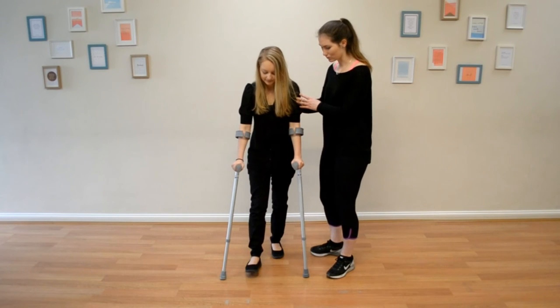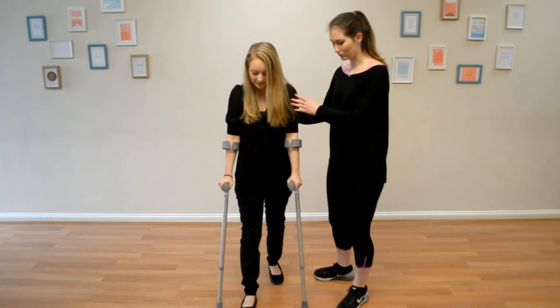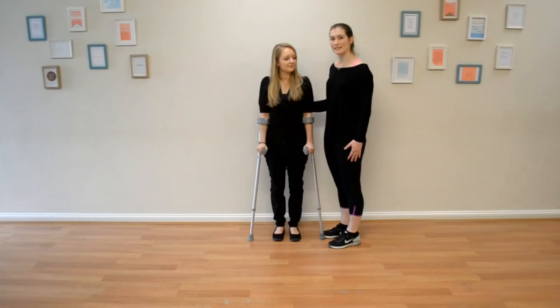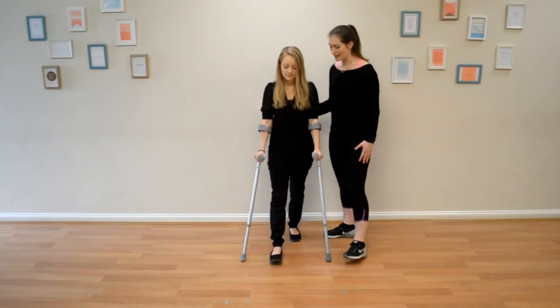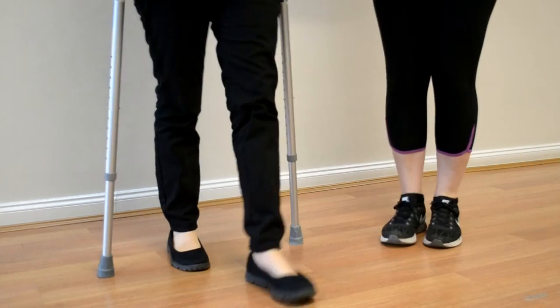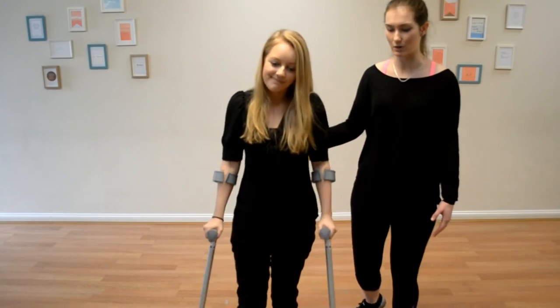The walking pattern is: crutches forward, then sore foot, then good foot — and repeat. Crutches, sore foot, good foot. Then step forward with your crutches and your sore leg at the same time, and now step through with your good leg. Then keep on walking naturally, using the arms to help you out.